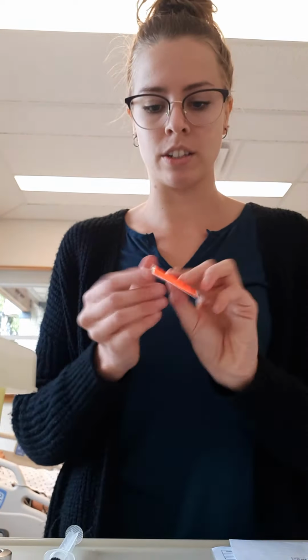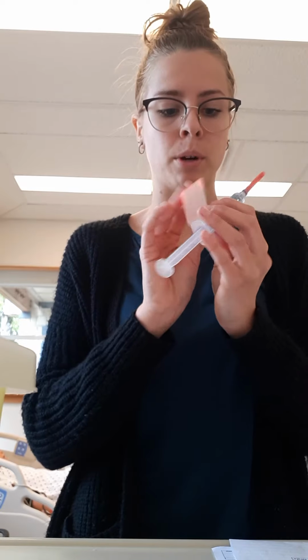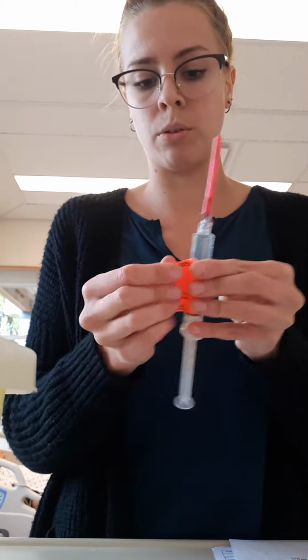I've filled out my medication labels, so I'm going to pop that on, attaching it to the syringe, not the cap, for safety purposes, because if I lose the cap, then no one has any information on what is inside the syringe.